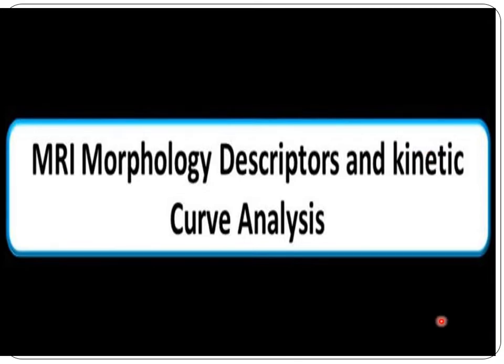About the breast MRI, what information can we get from it? First of all, the morphology of the lesion, if it's present. And number 2 is the functional property of the lesion. And this is done by the dynamic evaluation of the lesion.